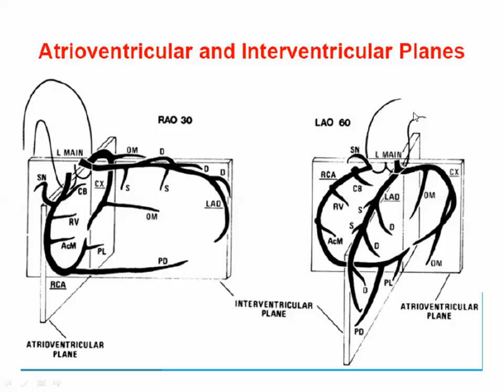What's this view? Where is the aorta? In this direction. So the aorta is here, spine is here, shaft is here, direction of ribs will be this, so it is LAO. So what are the walls of the left ventricle? SALI: septum, anterior, lateral, inferior. This is the inferior.